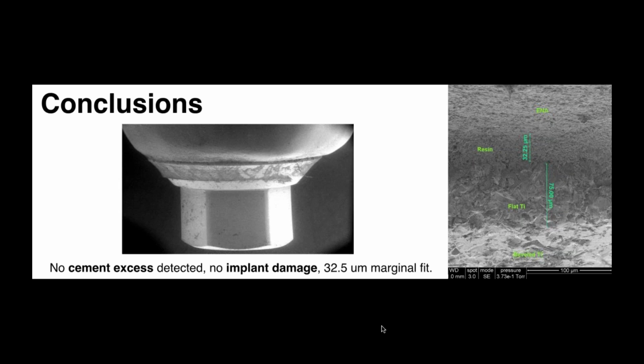If you've read more recent publications on the risk of peri-implantitis due to lack of complete removal of resin cement, that's something very concerning for us, right? We think that we remove all the excess of cement when we make an x-ray, but in the x-ray we only see the mesial and distal surface, but we don't see the facial or the lingual aspect of the implant and implant restoration. So that's why we really like to use tie bases, and we really like to use these implant solution blocks to be able to cement this extraorally and then provide a screw retained solution whenever possible.